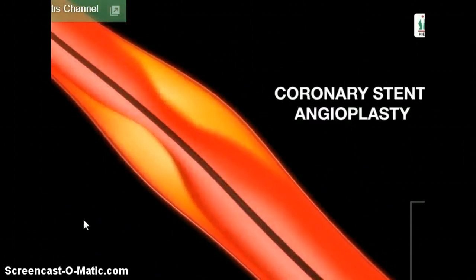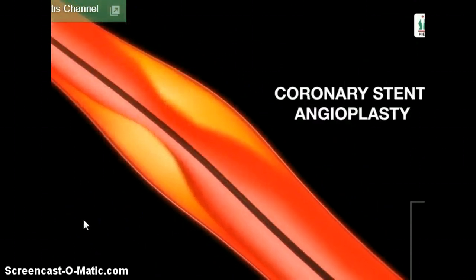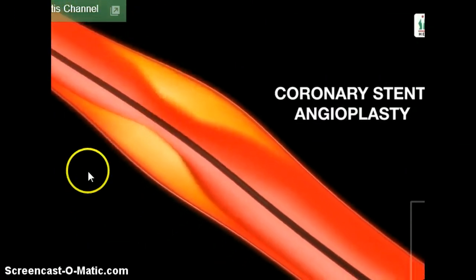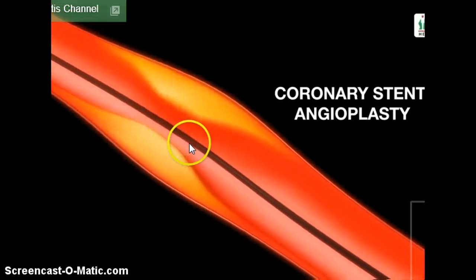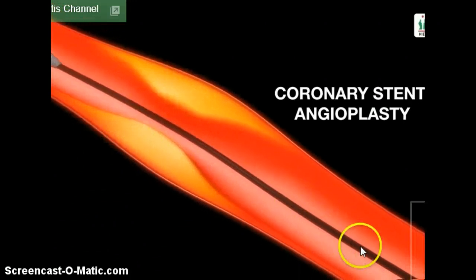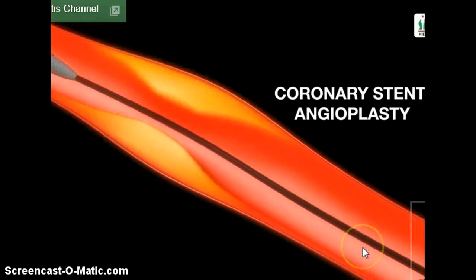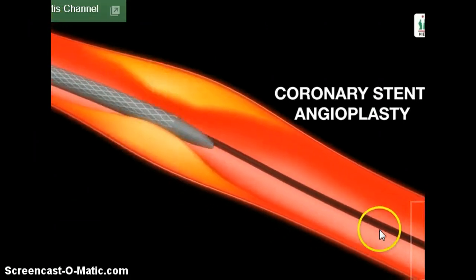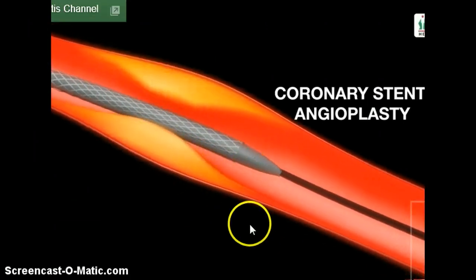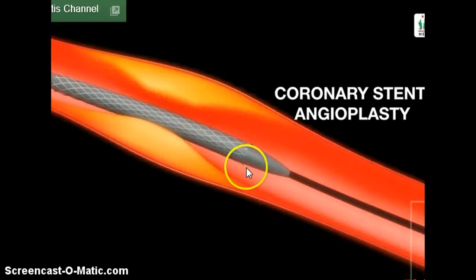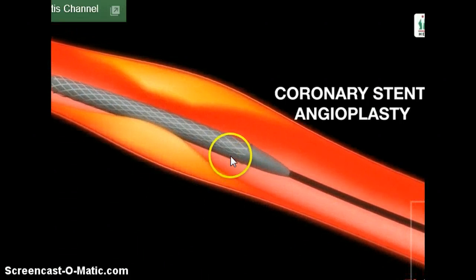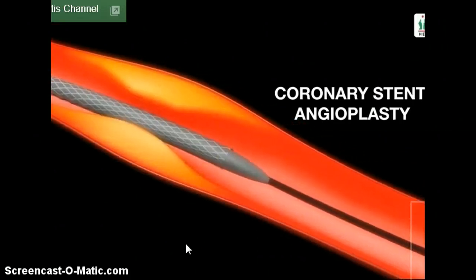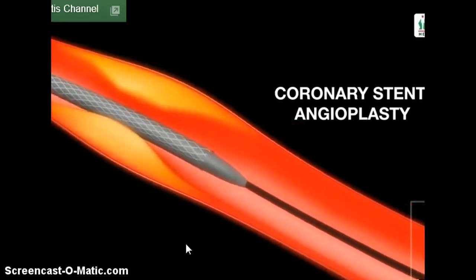The stent balloon catheter works in very much the same way. The 0.014 wire — your thinner wire — crosses the lesion. Here comes the balloon catheter with a stent mounted onto that balloon. The balloon will be inflated.